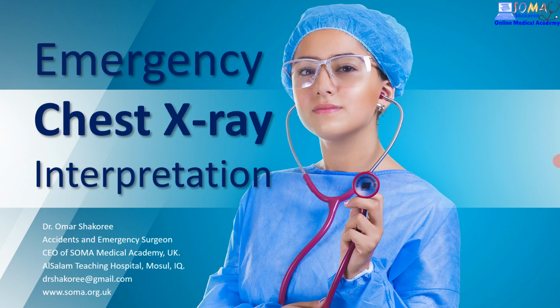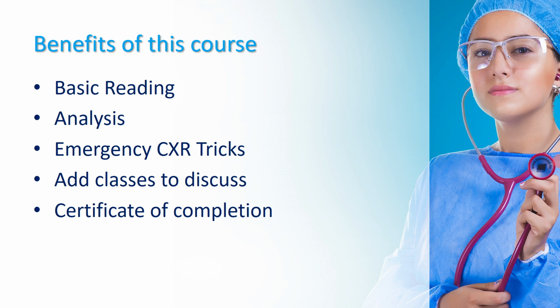This is Dr. Omar Shakori, accident and emergency surgeon, and today you will learn about emergency chest X-ray interpretation in a simple way. The benefit of this course will be you will learn the basic reading of chest X-ray in the emergency department for trauma patient and non-trauma patient.